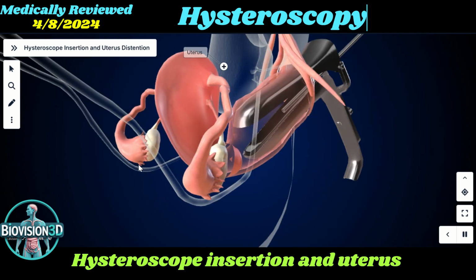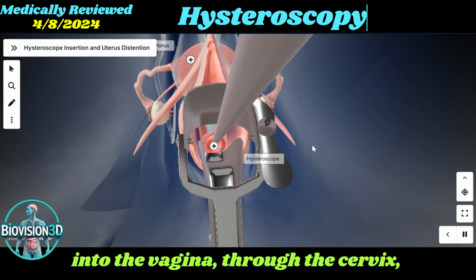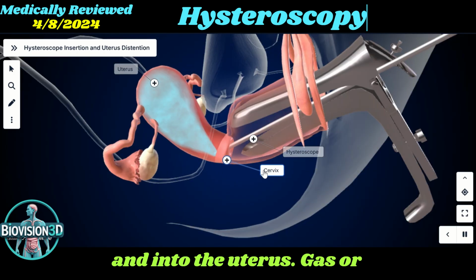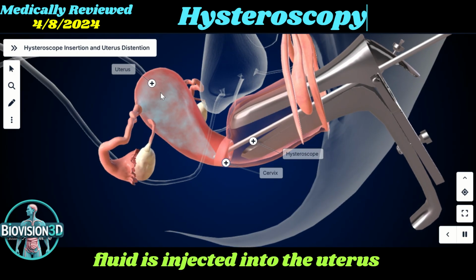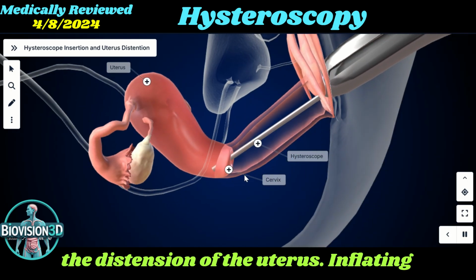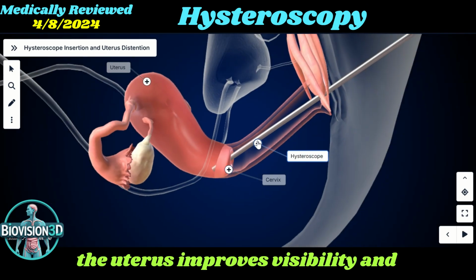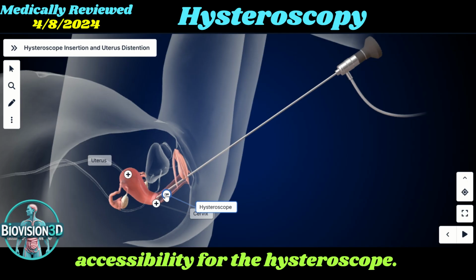Hysteroscope insertion and uterus distension. The hysteroscope is inserted into the vagina, through the cervix, and into the uterus. Gas or fluid is injected into the uterus through the hysteroscope, resulting in the distension of the uterus. Inflating the uterus improves visibility and accessibility for the hysteroscope.